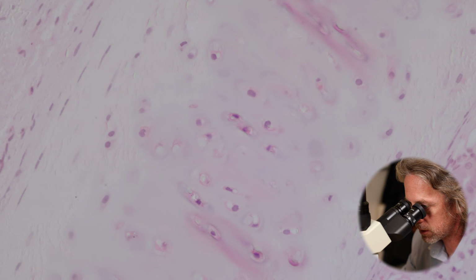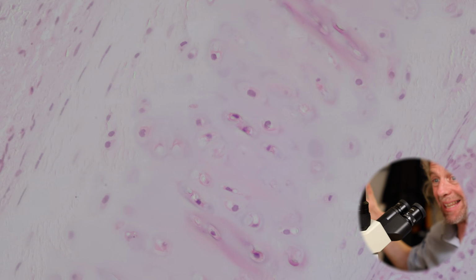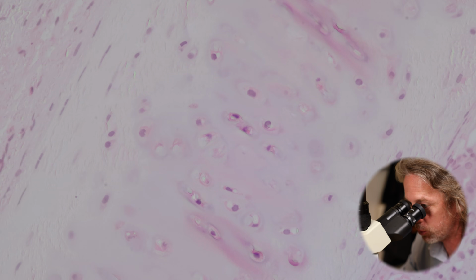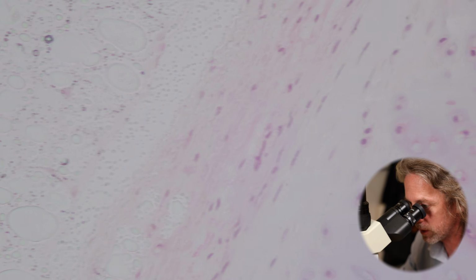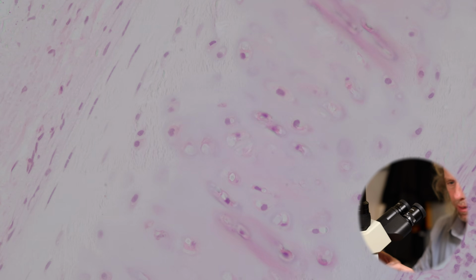So cartilage looks quite different, looks quite special. There is a lot of extracellular matrix, and there are very few cells. So the cells are the chondrocytes, and the cells are maintaining the cartilage. This is a hyaline cartilage. So they're making the extracellular matrix. They're putting the collagen and the proteoglycans and the GAGs in there and making this structure. So we've got this kind of slightly flexible, slightly rigid C-shaped tube which keeps the trachea open. On either side you can see there are some cells running kind of longitudinally, the perichondrium, which is supporting the cartilage ring. So that's what the cartilage ring looks like.